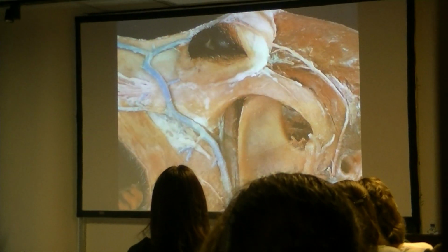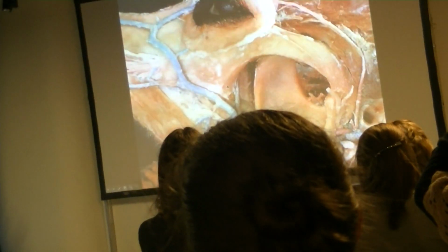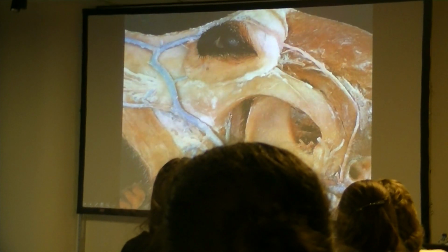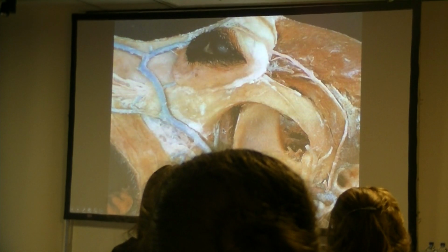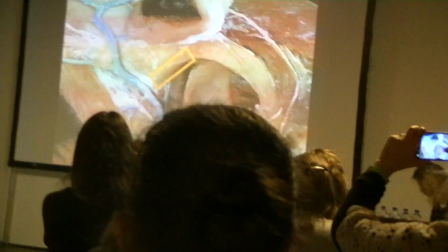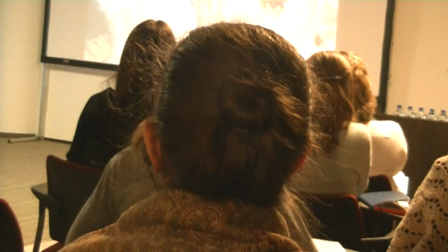Just a reminder then of our zygomatic gland. The zygomatic gland is situated on the medial aspect of the zygomatic arch itself. This is the zygomatic bone, and this is the ramus of the jaw. And we said the ramus will apply pressure when the jaw is open. So to get access here, sometimes we need to take a window out of the ramus itself, of the zygoma, and we can do that either using an osteotome or using a saw or a high-speed or a low-speed drill.